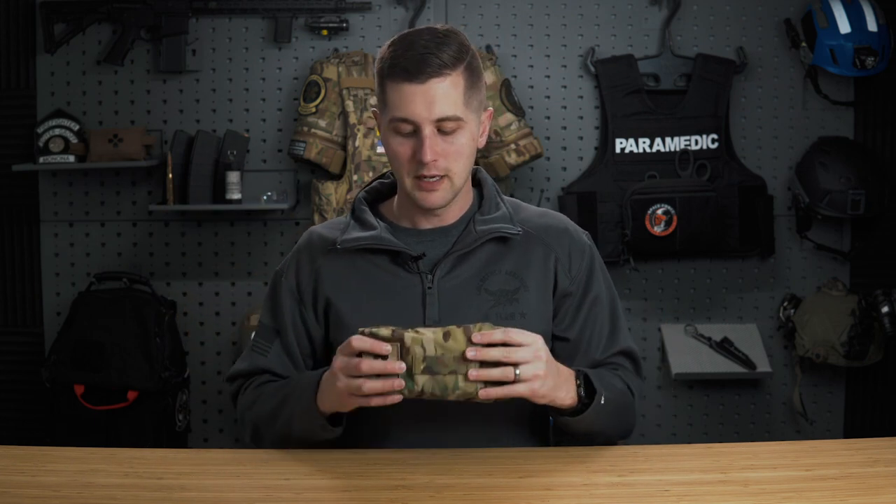Full disclaimer: I don't make any money off these guys. They did send me this for free, but this is definitely something that is going on my kit in the tactical world, and actually something I'm going to start carrying on the helicopter because I did have a situation where this would have been very useful.